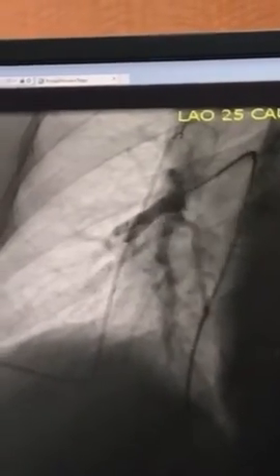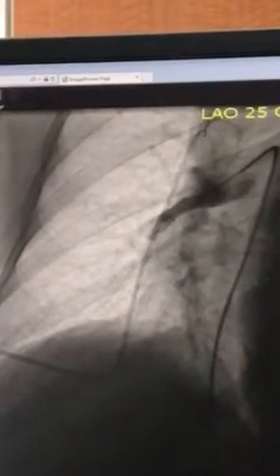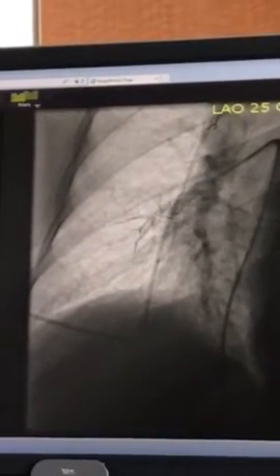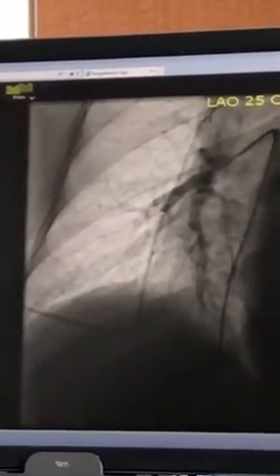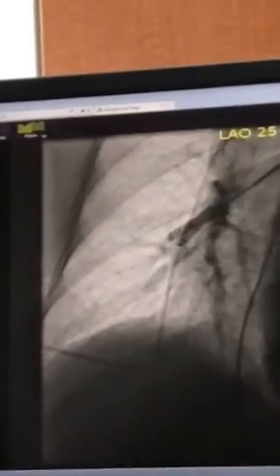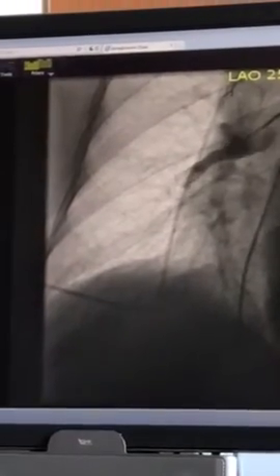So we don't want to get too aggressive with the ballooning, because that's how we end up sort of encountering complications. So we want to leave this and let it remodel. And you are somebody that, even in the cath lab, Dr. Mahmood was talking about the idea of, we like to get everything done in 6 procedures, but maybe for somebody like you, maybe we need to do a 7th and an 8th. And certainly that wouldn't be out of the realm of possibility in what's been done elsewhere around the world. So that was the middle lobe.